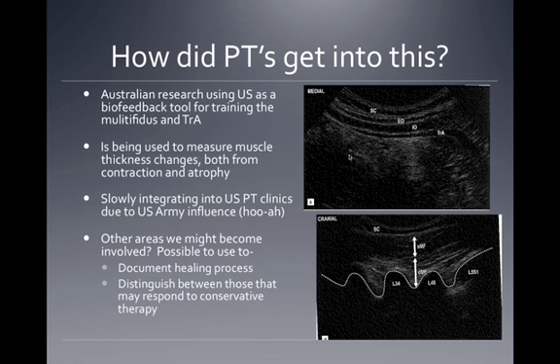So what else can we use this for? And that's probably where we're going to end up getting ourselves in a little bit of trouble, because it's really easy to say, well, gosh, I want to look for something else. And I get people all the time walking in the office saying, can you look at my shoulder? Can you look at my neck? Can you look at my knee? And the diagnostic area is where we're going to get ourselves into trouble. So it is opening up a little bit of Pandora's box in our clinics as well.